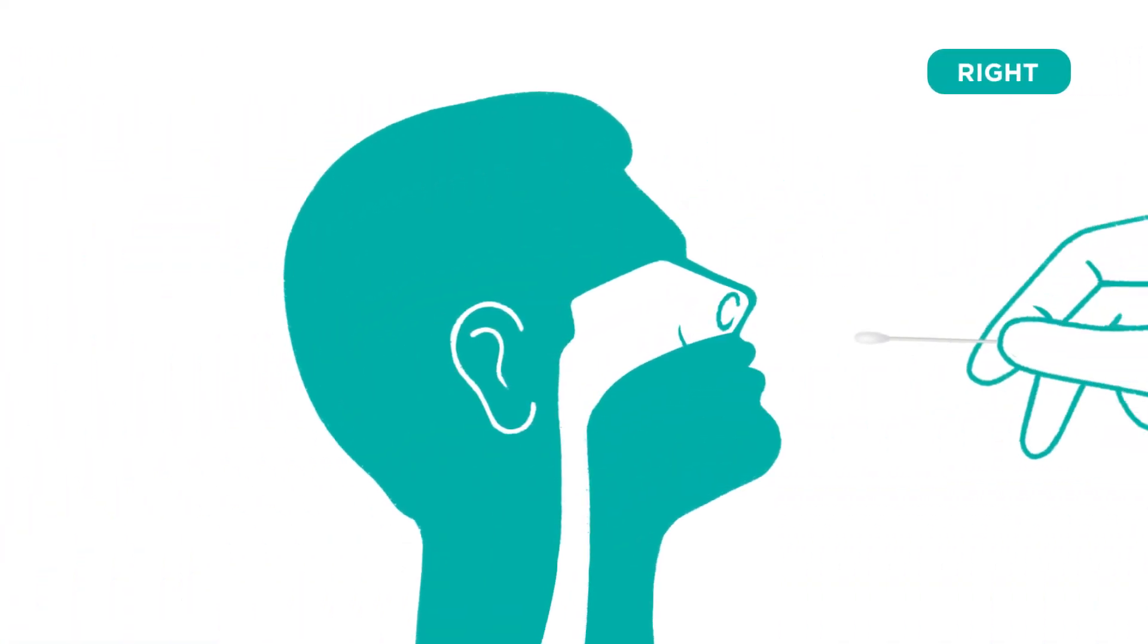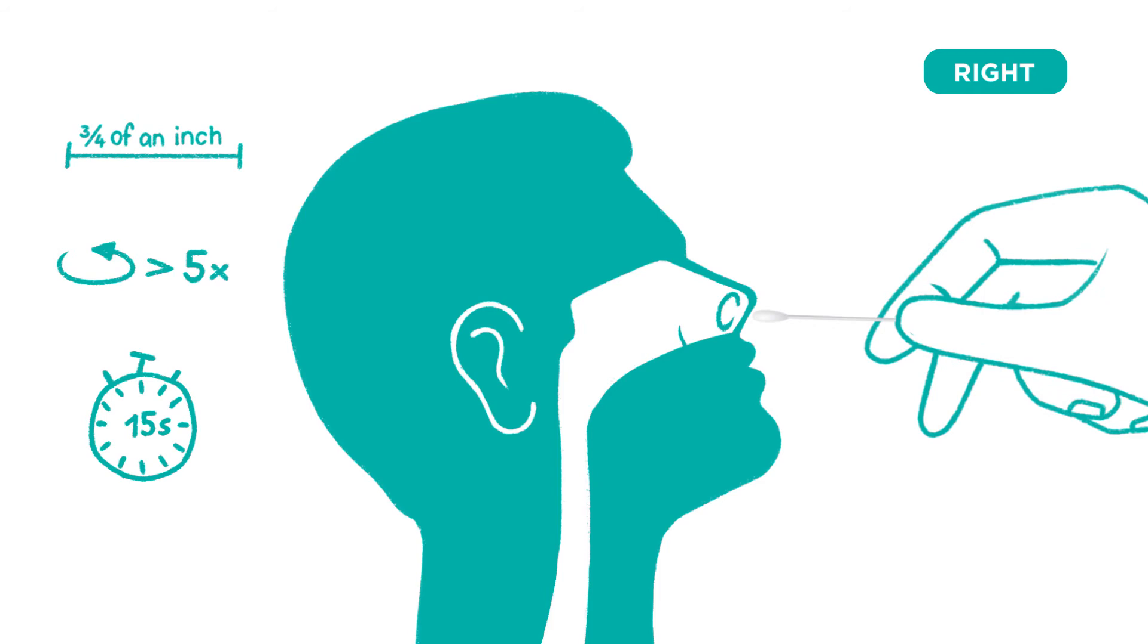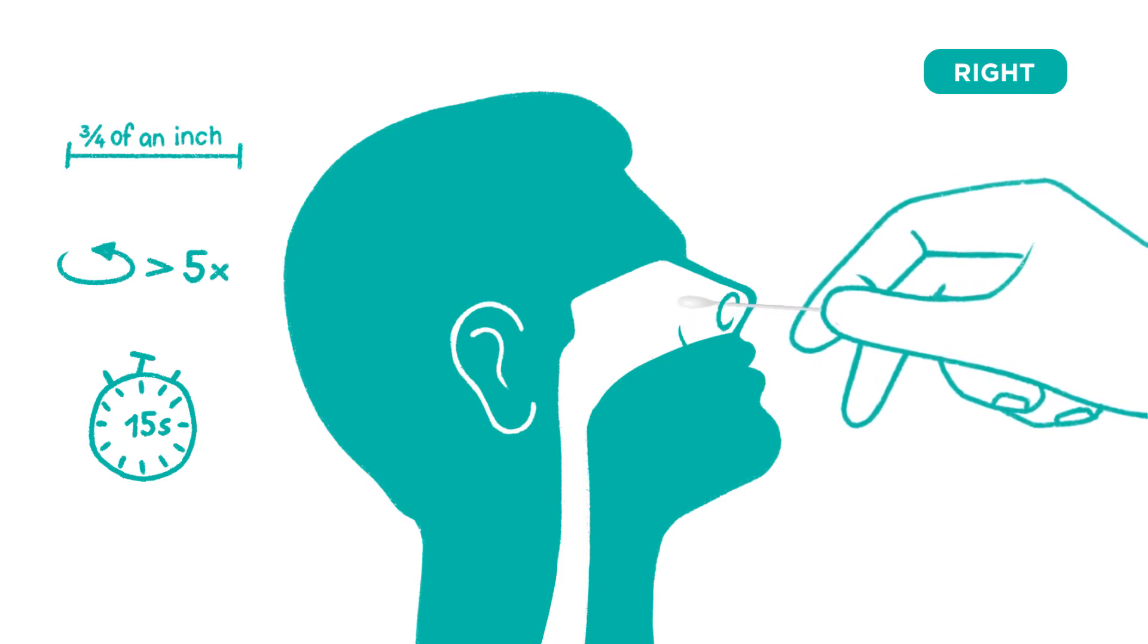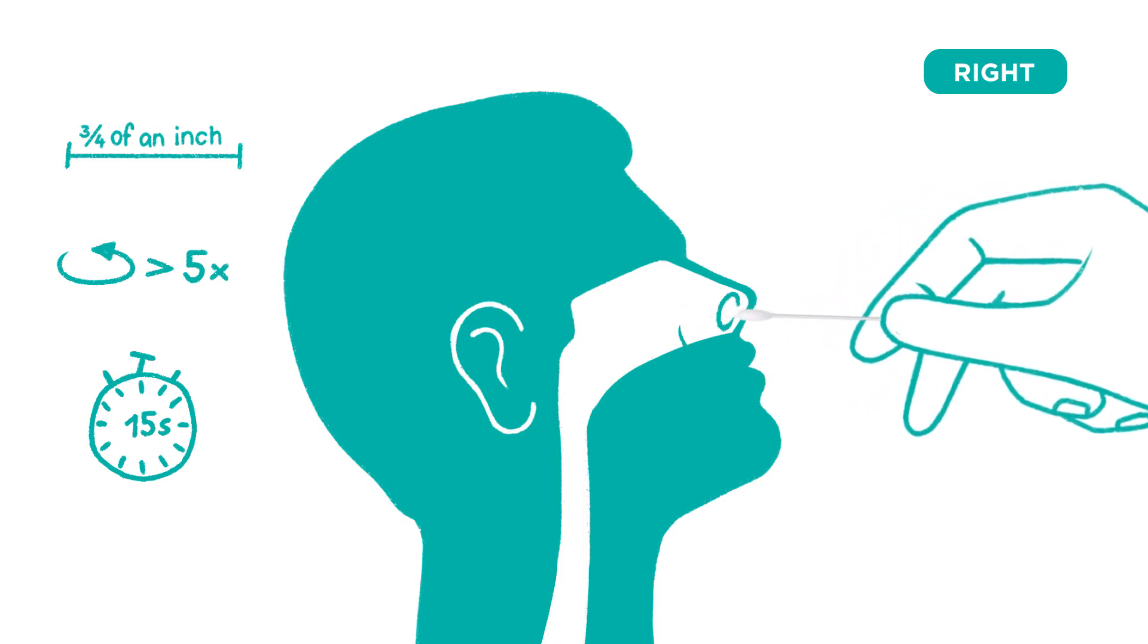Next, place the swab directly into the right nostril, repeating the process of rotating at least five times in a circular path for 15 seconds. Carefully remove the swab from the right nostril.